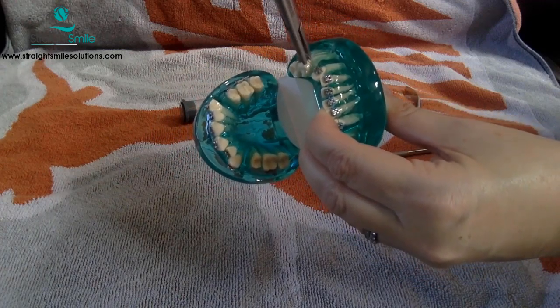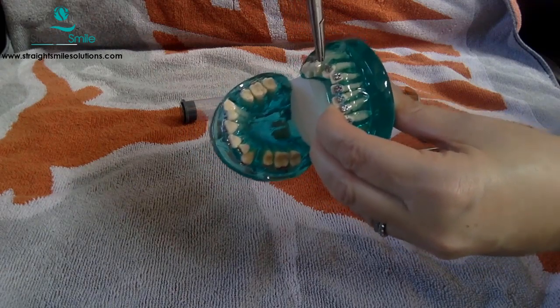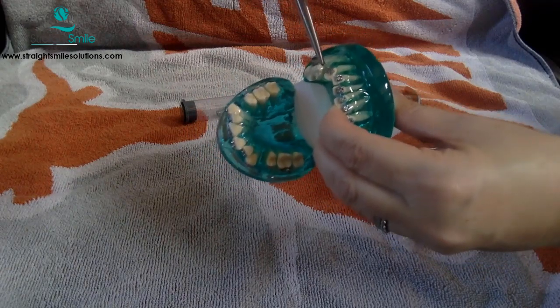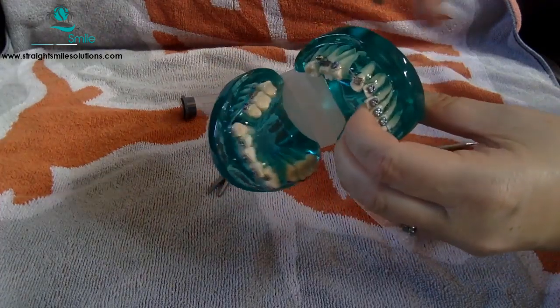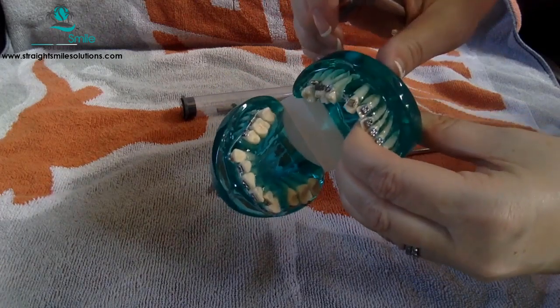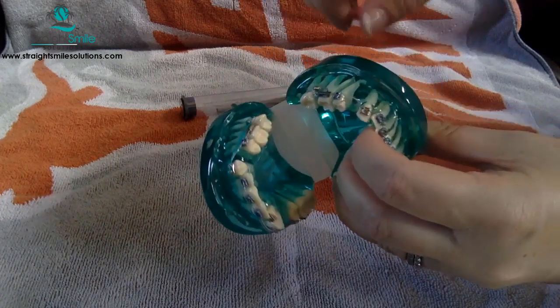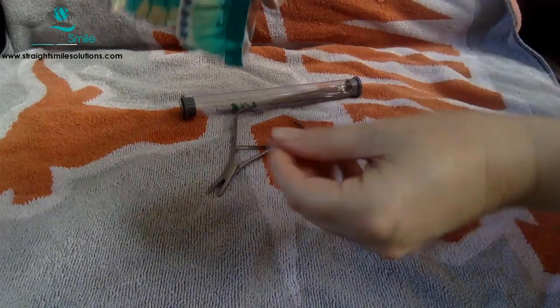Let me hold it a little further down. Once you start to see it double back on itself, which it's doing already, you're going to stop. You're going to get your pin cutter and cut it with a little flash at the end. You shouldn't cut it flush, otherwise it's going to unravel. With a little flash at the end, and then we'll teach you how to tuck it under. And there's the flash right there.